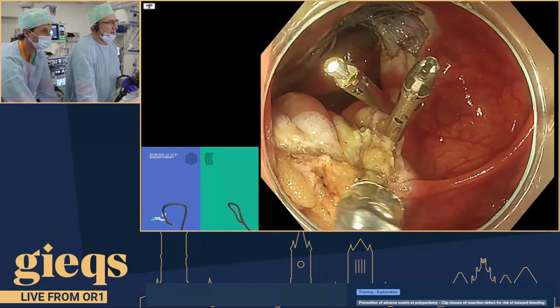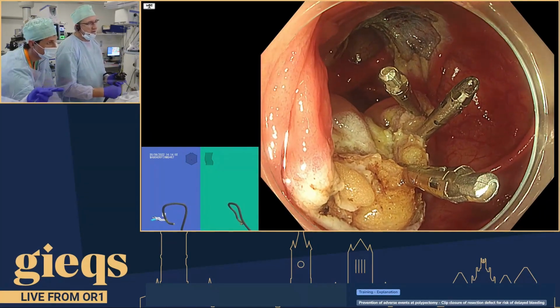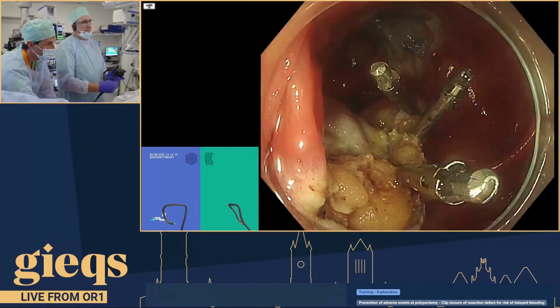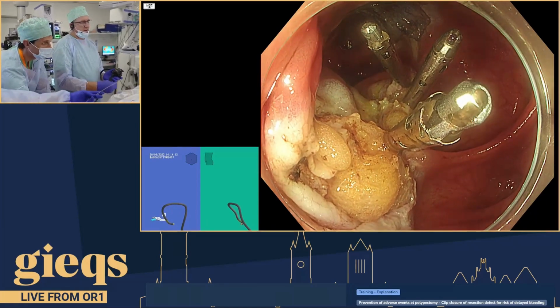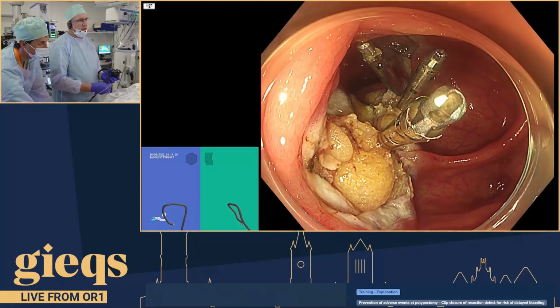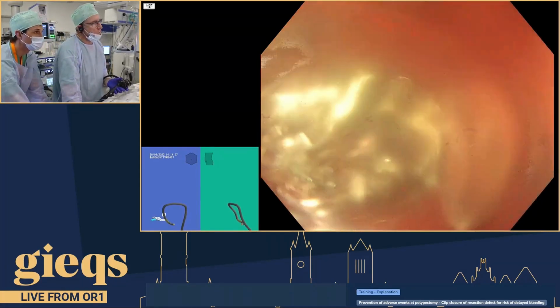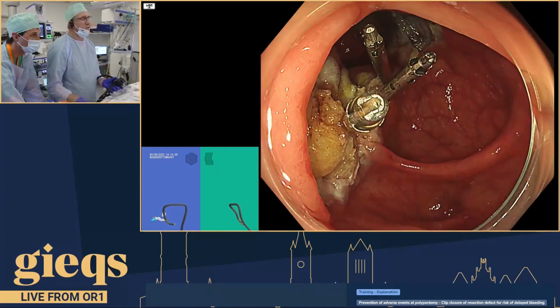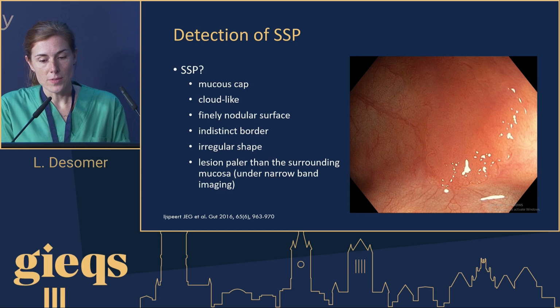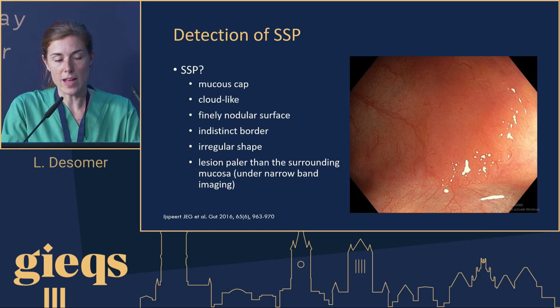And we know from the data that full closure reduces bleeding risk in the right colon from 10 to 12% to 3%, and partial closure takes it down to 5%. And there's good evidence. There are 3 large randomized trials, including our own, which was just published in Lancet Gastroenterology and Hepatology. Now the next thing is, you don't want the stems of the clips to fall across the wound. You should look that up. It's quite interesting. Now, David's already shown the WASP criteria published by the group in Amsterdam.